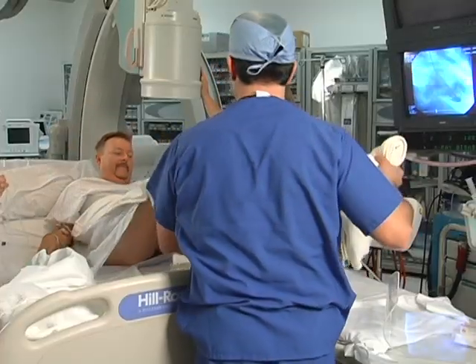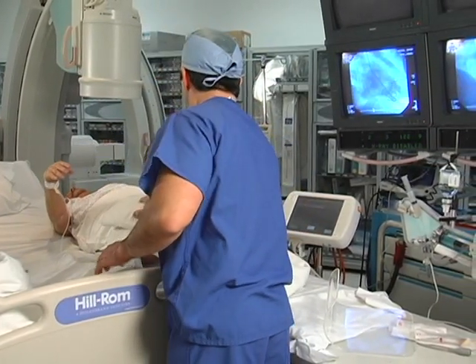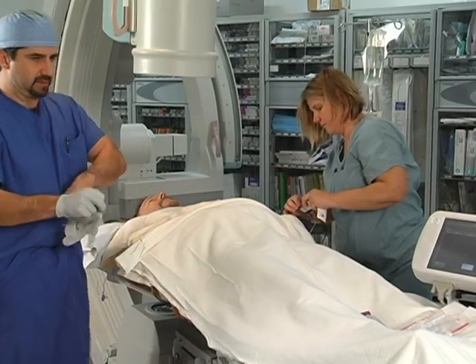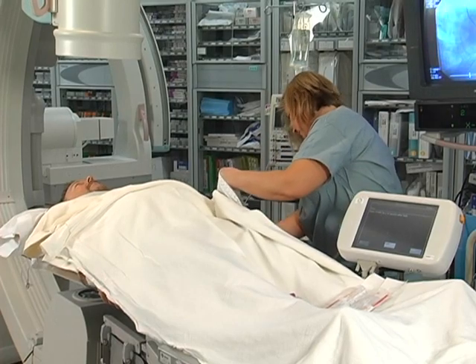The patient enters the cath lab and is transferred to the X-ray table. The nurses then prepare the patient for the imaging and vascular access. The electrocardiographic leads are applied to the chest. The patient is checked for a working IV. The emergency equipment is prepared for the patient.